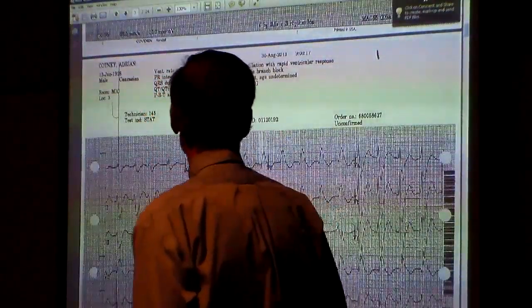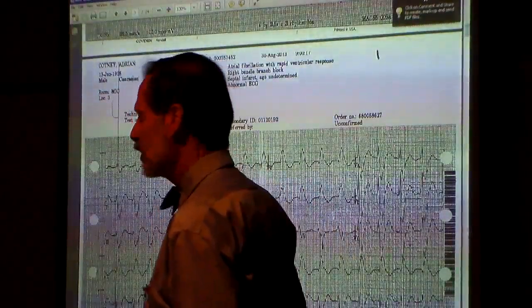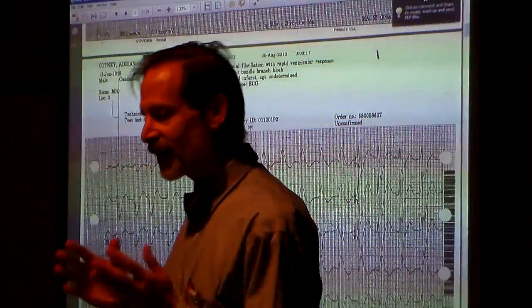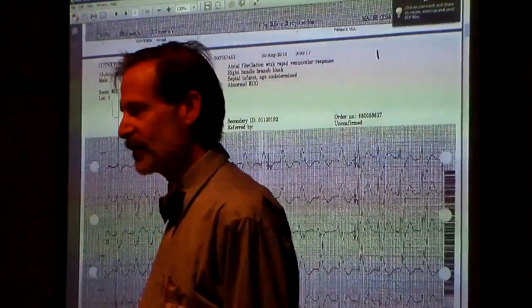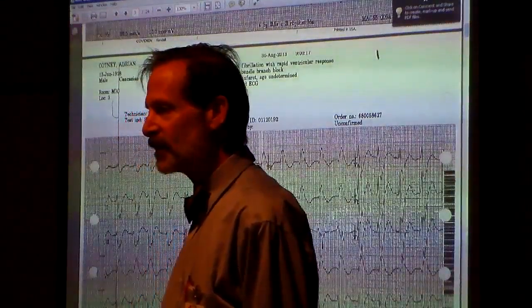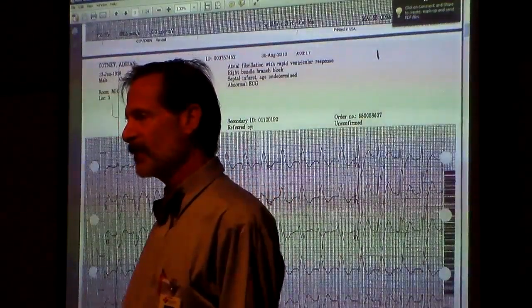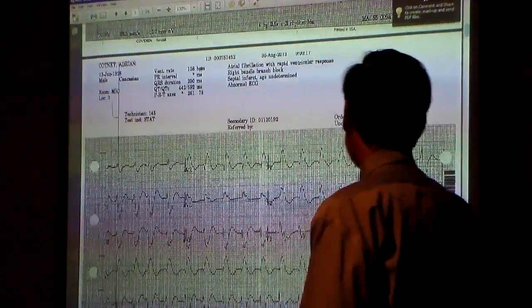Dr. Patel, how do you differentiate between an intraventricular block and right or left bundle branch block? That's a good question. If they don't have the classic right bundle or left bundle, you just call it IVCD, intraventricular conduction delay. Is there some specific characterization? No, just the specific things for right bundle and left bundle, and if it doesn't fall into those, you just call it that.